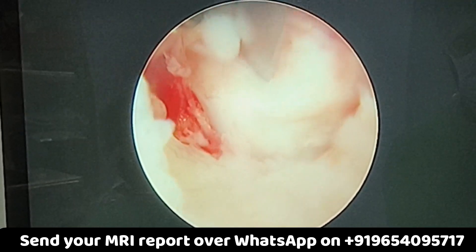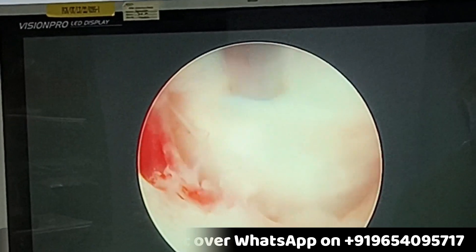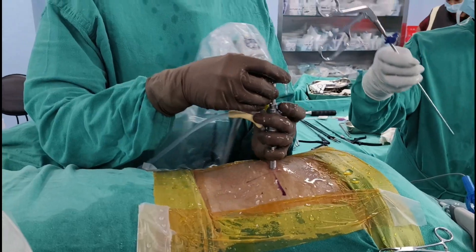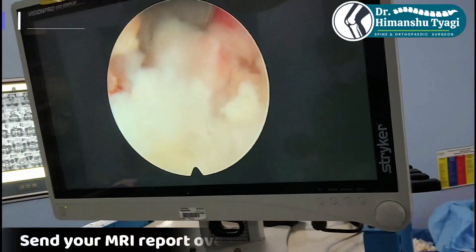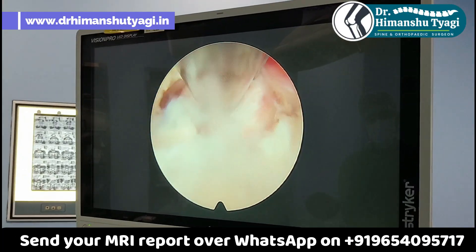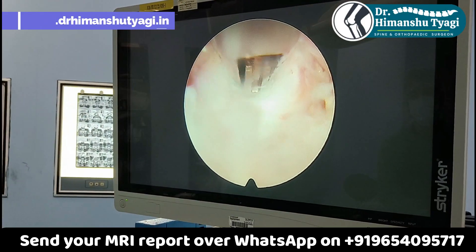Here you can see we are giving small stab incisions over that part of the disc which has come out and is pressing the nerve. Once we are sure that we will be able to remove that fragment, we use special forceps to remove it. Here you can see by using those forceps we are taking out the disc fragment.